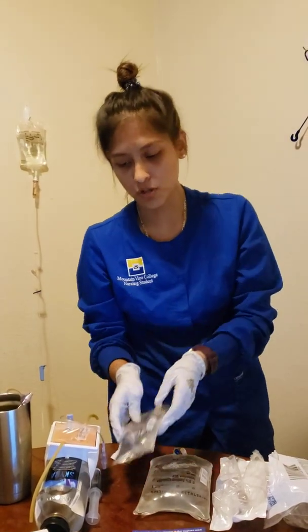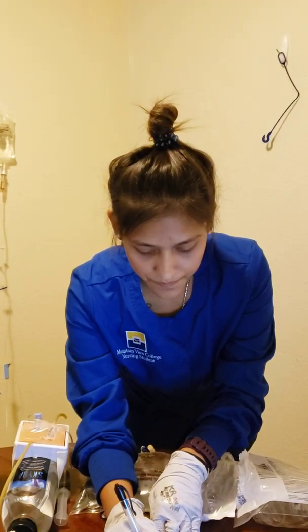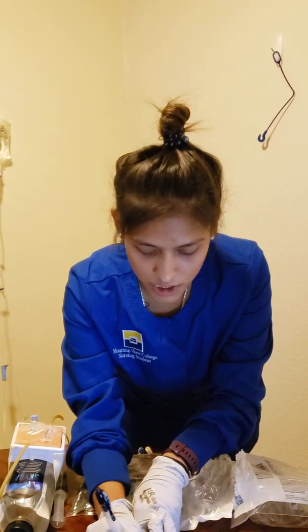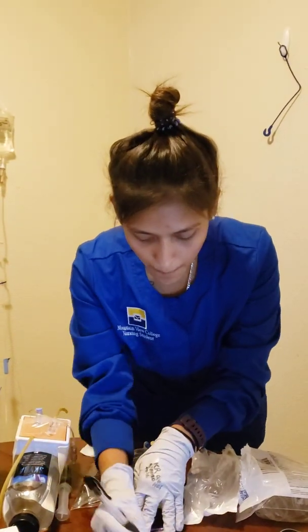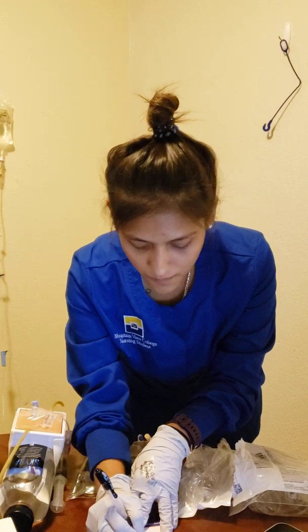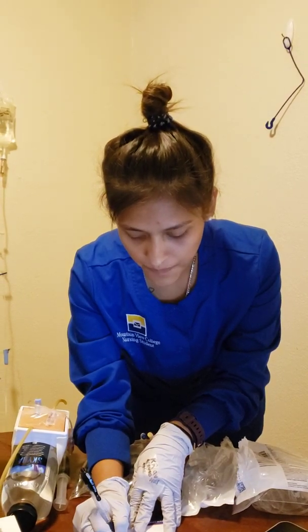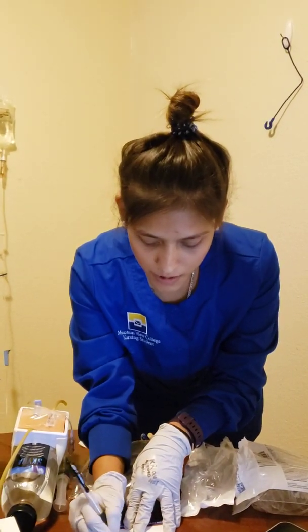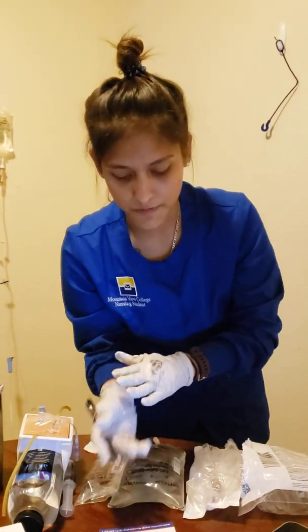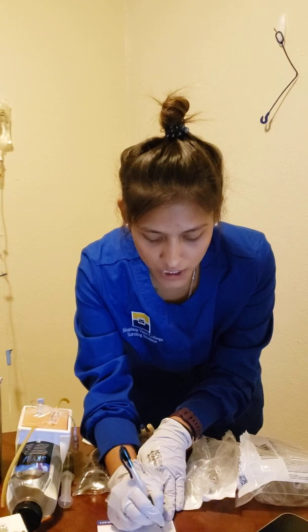So I'm going to have to do some dosage calculations really quick. I'm going to do 500 ml over 10 hours, which is going to equal 50 ml per hour. And then I'm going to do a drop rate, which I will show you at the end. 500 ml over 600 minutes times 60 drops per milliliter, which is going to equal 50 drops per minute, which is then going to equal about 13 drops per 15 seconds.